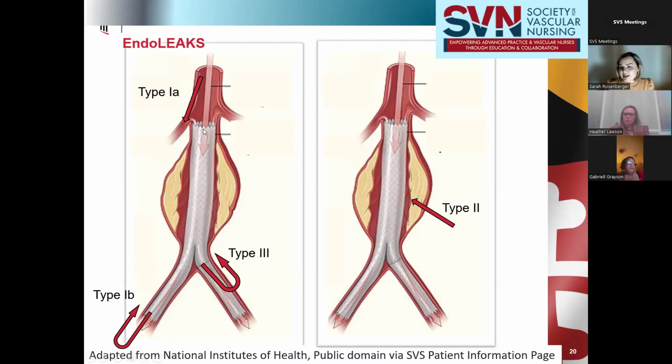And so a type 1A or a type 1 or a type 3 endoleak always requires intervention, because that sac is pressurized and you no longer have protection against rupture. The type 2 endoleak, like we talked about with the backwards flow, goes through the arterioles and the smaller blood vessels through which this blood snakes until it eventually finds its way down into the depressurized sac.